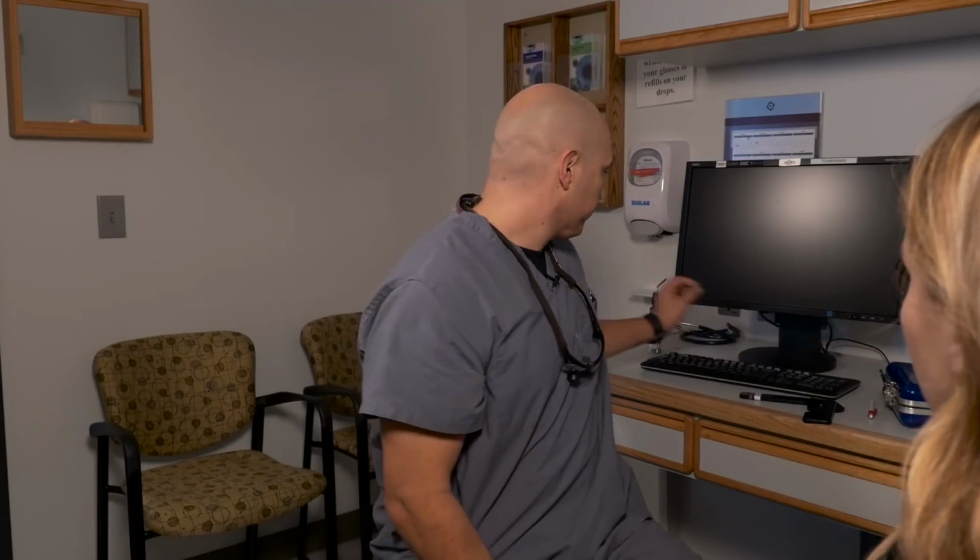Is that the same color red between both eyes? Yes. Okay, now I want you to look straight ahead at that light switch again, and I'm going to bring this pen in from the side. Tell me if that pen looks any brighter or darker on one side versus the other. Okay, good. So that's checking for red desaturation.